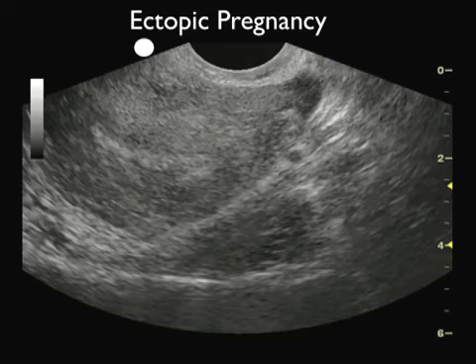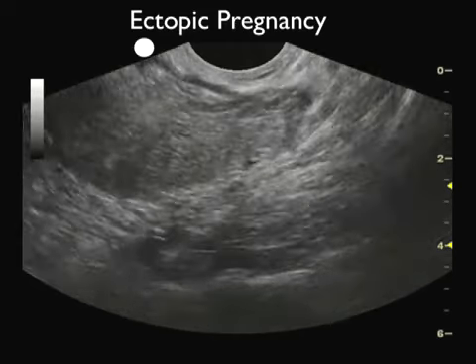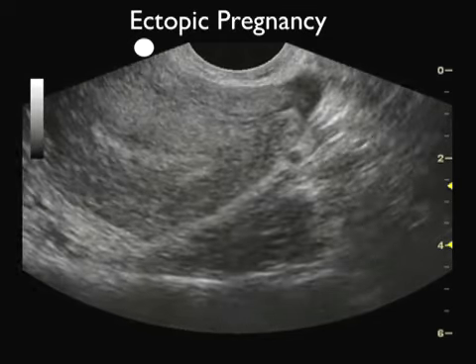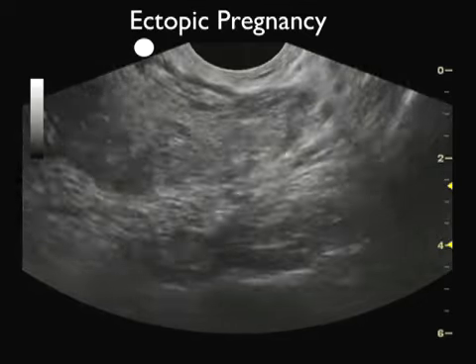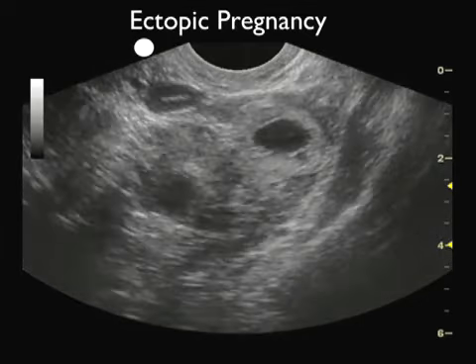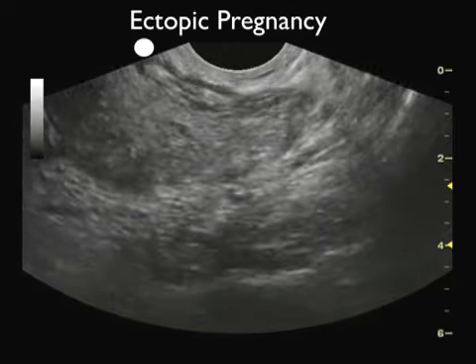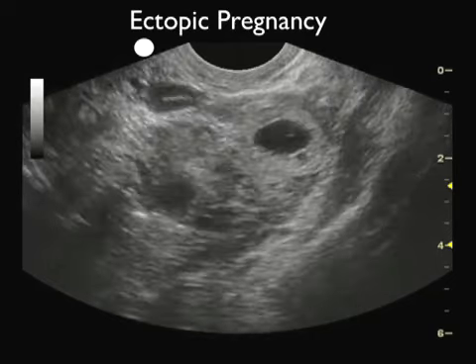Here's another version of an ectopic pregnancy. Again, we're scanning from the midline uterus, and we fail to appreciate any intrauterine pregnancy. And as we scan out towards the left adnexa, we see a positive finding right there. We notice a thickened fallopian tube with contents inside.